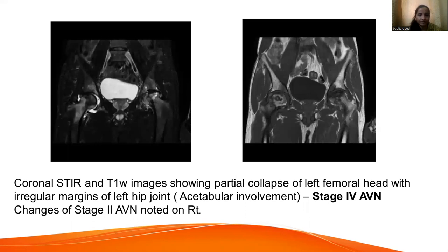This MRI image shows coronal STIR and T1 weighted images showing partial collapse of the left femoral head with irregular margins of the left hip joint. There is acetabular involvement. This is seen in stage four AVN, and changes of stage two AVN are noted on the right.